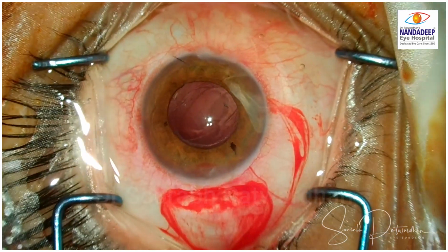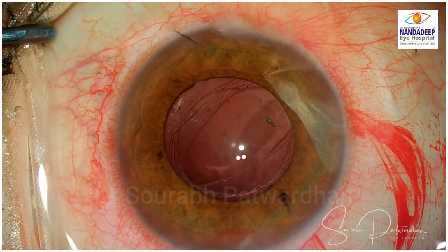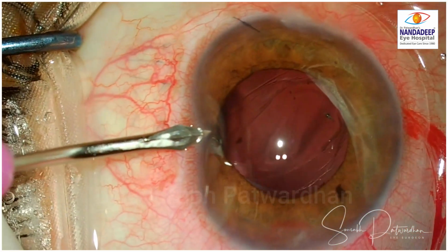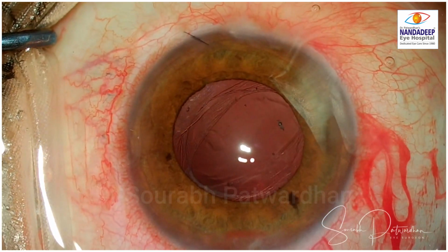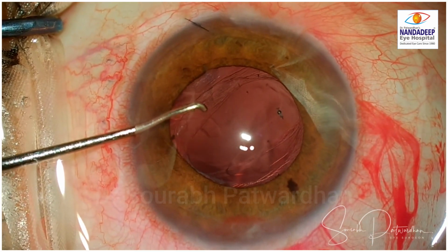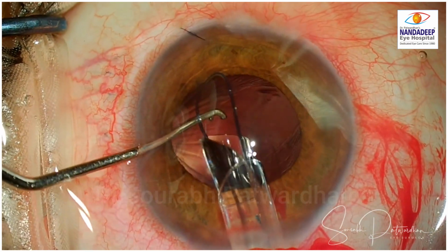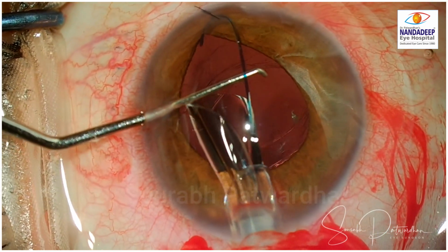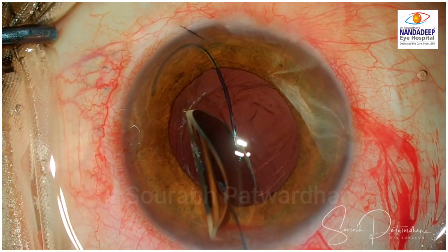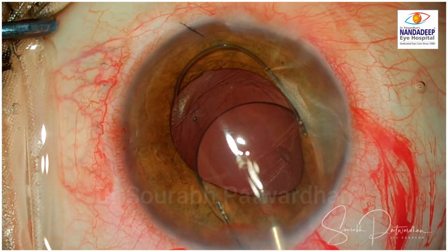Now I can directly insert it in the anterior chamber as well, because I already made a 6 mm large scleral tunnel, but here I decided to inject it through the B cartridge. Sometimes it's easier to do it this way, and the important thing is to let this IOL open in the anterior chamber and do not try to push it into the sulcus in the first go, because sometimes the haptic may just pass into the bag and may go into the vitreous if you are not careful.